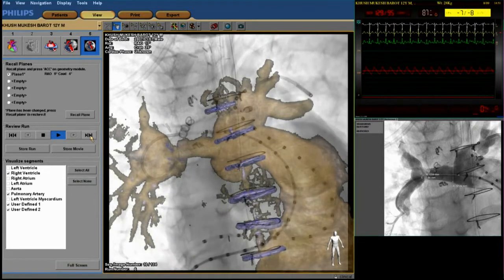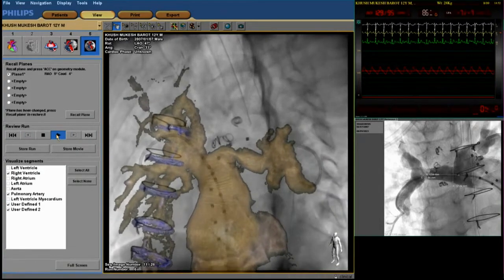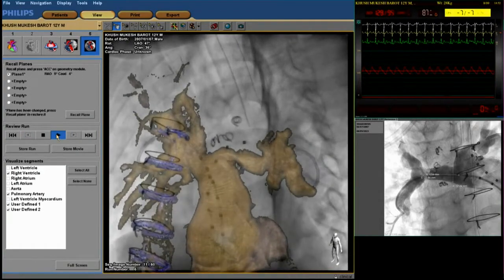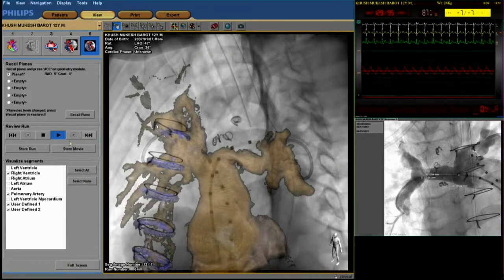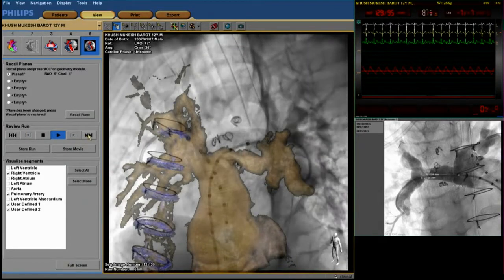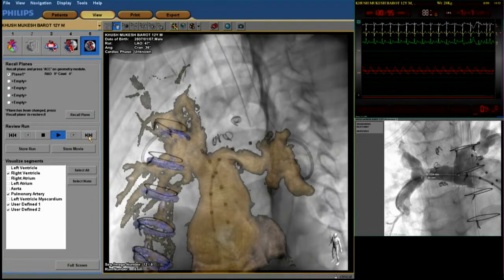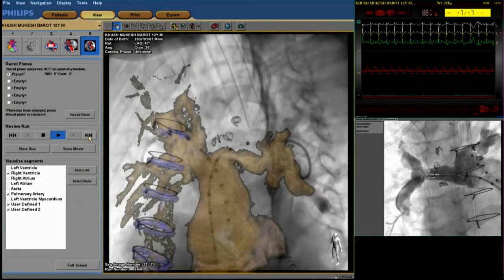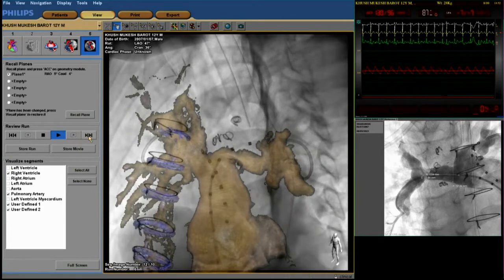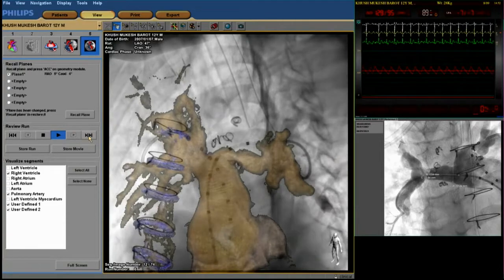And then for the left pulmonary artery, he showed that this is the angiogram that is going to show the best profile, and then it was easy for us to make the angiogram. Run the angiogram and fuse it. That is the angiogram and we could fuse it. You can see that they are using fiducial markers of the sternal wires. They are trying to overlap the sternal wires on the CT scan and the sternal wires on fluoroscopy to get this picture. Can you show the fixed image of the LPA stenosis?